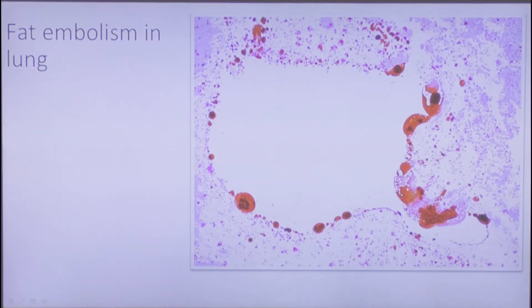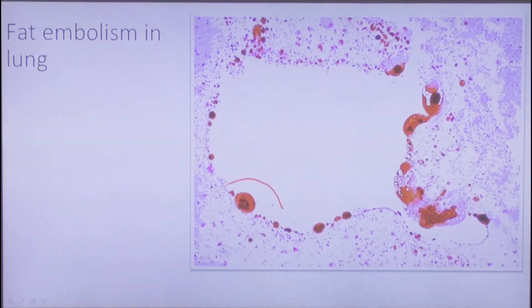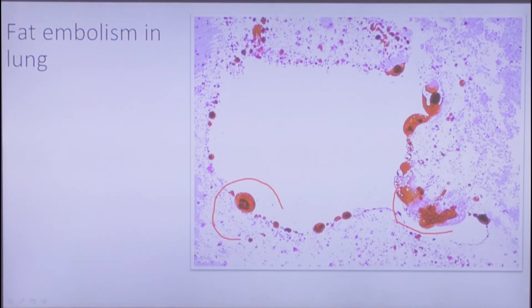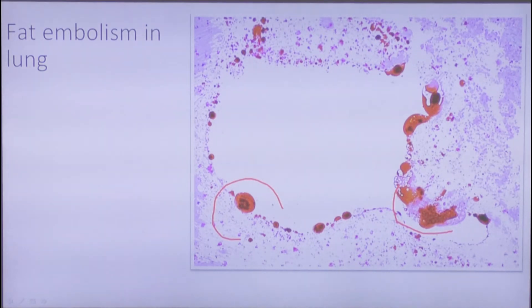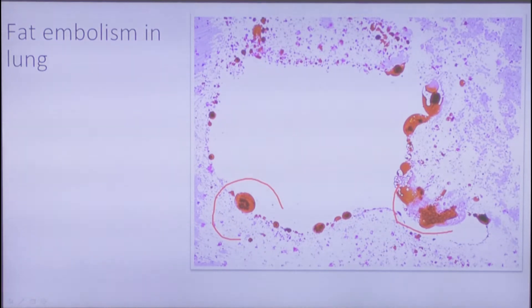Here are alveoli shown with particles of fat. This is a special stain that colors fat in red, because the classical hematoxylin and eosin stain makes fat colorless. That is why, prior to establishing a diagnosis of fat embolism, we should suspect it and know which stain to use.